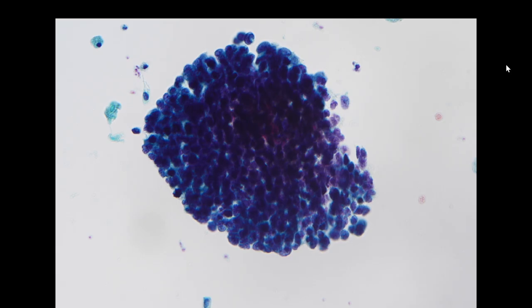So here we have a very good example of small cell carcinoma in the urine, and because the patient is confirmed to have a prostate location with small cell carcinoma, this is compatible with prostate shedding.